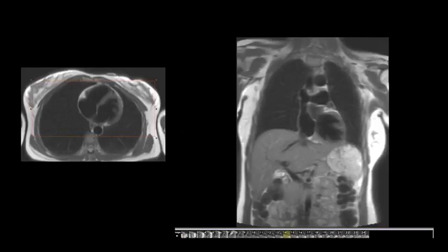If we are to acquire our slices in the coronal, again you decide on the region of interest, which is the heart again. So you go just anterior to the heart, make sure that the aorta is with you in the acquisition. We are not interested in this region, and you cover from one side of the chest to another. Again, we are not interested in the arms outside.